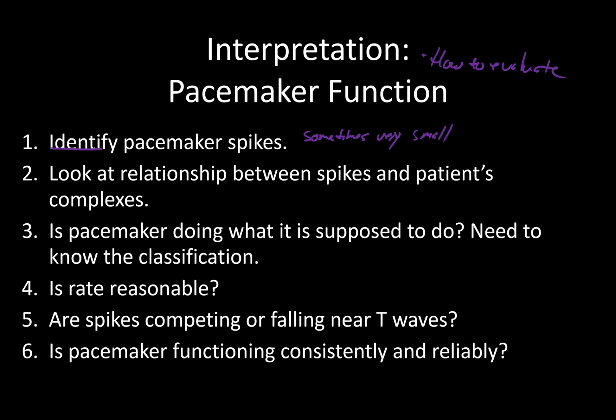In fact, you may not even see them on the ECG strip, and we rely on our monitors to help give us an indication if that thing's happening. Of course, you can always check your patient, because they should have a pacemaker implanted in their chest. If that's there, then obviously we have to dig in and figure out if their pacemaker is functioning or not.